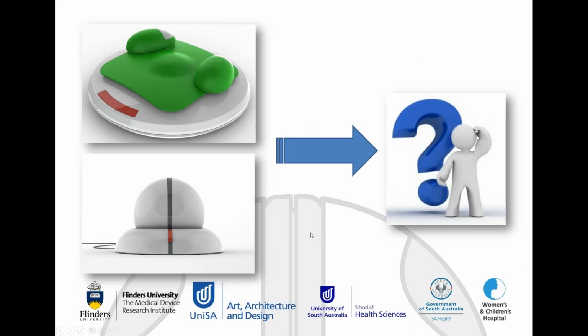What we ended up coming up with, and just to show you that that was just one aspect of ideation, was these 2 controllers here. So shown on the left, starting at the top, one of the industrial designers took the approach that if we could just get them to put their hands on 2 curved objects, and if we can reinforce the fact that we're using computer technology, and so they took a mouse approach, so these look like mice. And then on this particular device, you move the green plate forward, backward, left and right, and it just moves on top of that circular base, the white base here.